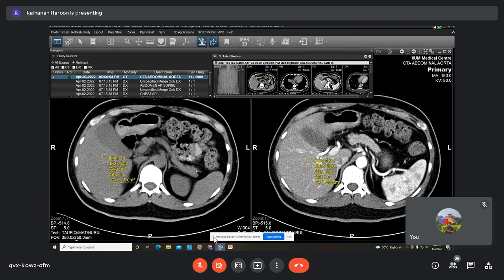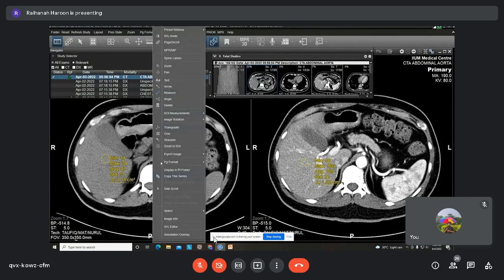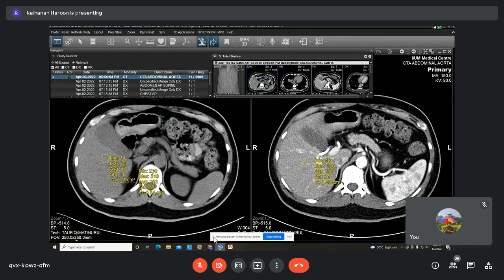As a structure is more dense, more opaque, like bone, the density increases. And you can have an idea, if you see a density, whether it's metal or bone. You can even discriminate to that extent. For example, if I put it here on bone, it's about 250, as compared to the liver's 47 only. And this is liver plain, no contrast. And then I'm interested in the omentum, probably the mesentery, or the subcutaneous fat.